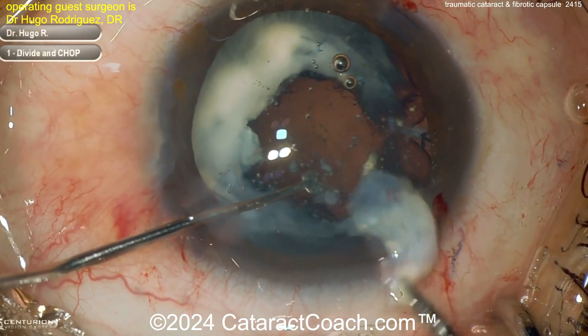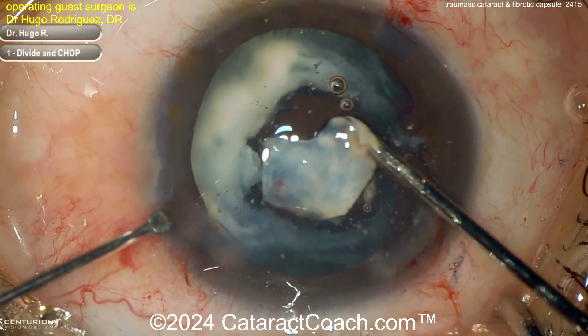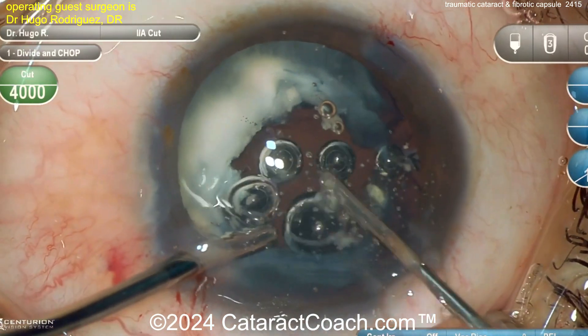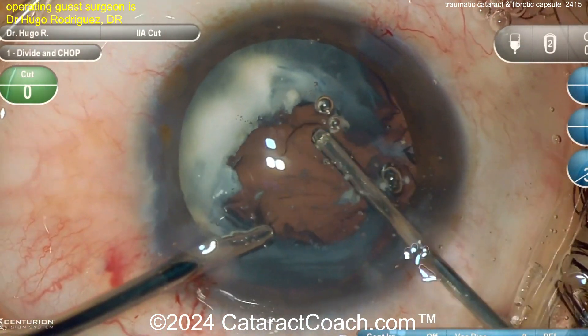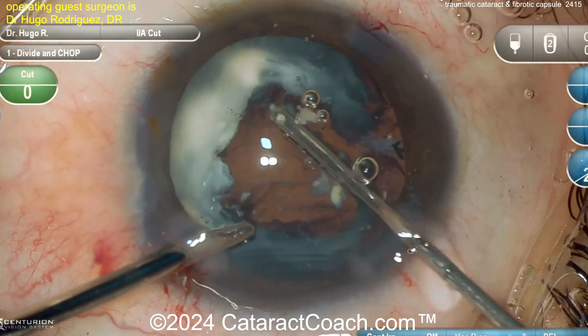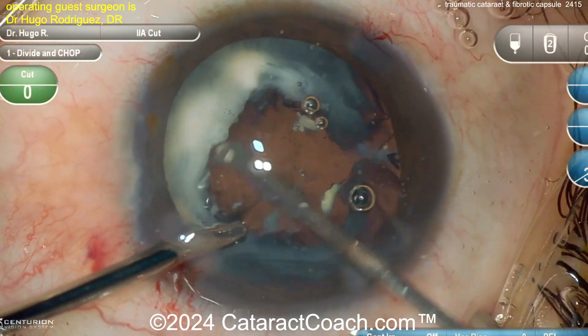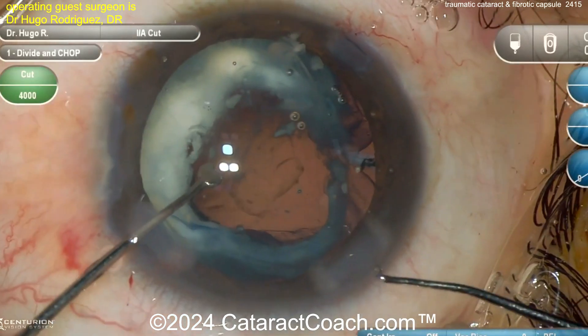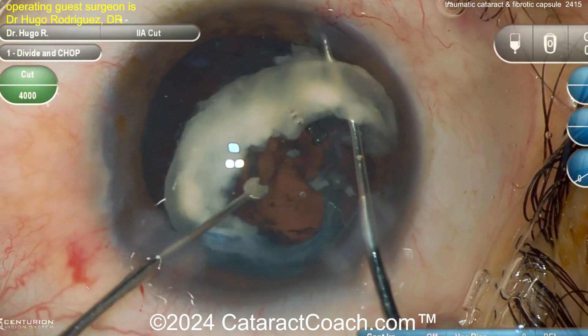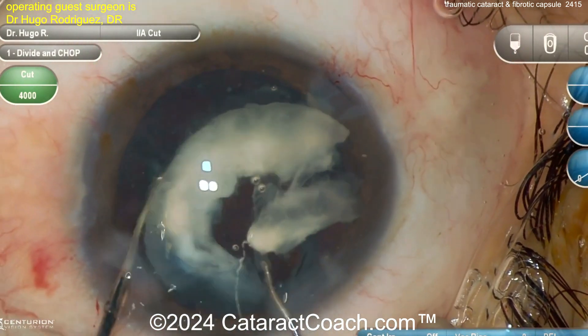Now using micro scissors here to try to cut this material, or forceps to pull it out of the eye. This is very unusual. Trying to get some sort of round opening in the entire lens capsule, because all this lens material has to be cleared out. Now going in with a small-gauge vitrector to loosen up this shell of lens material.